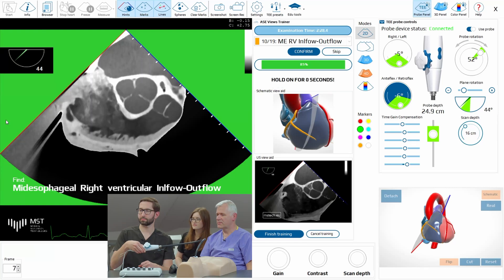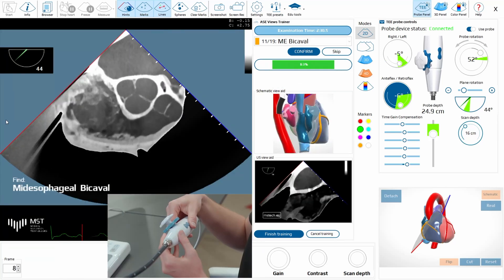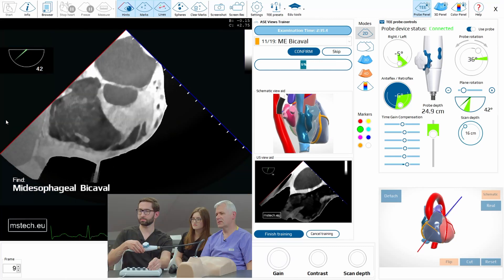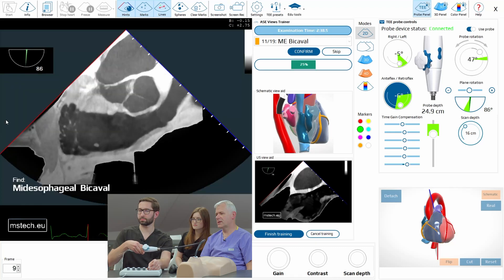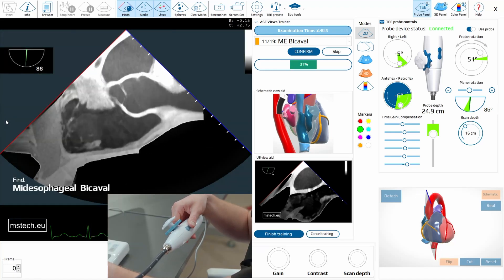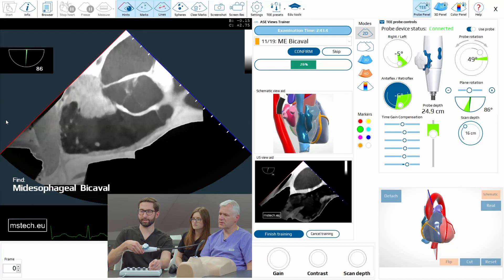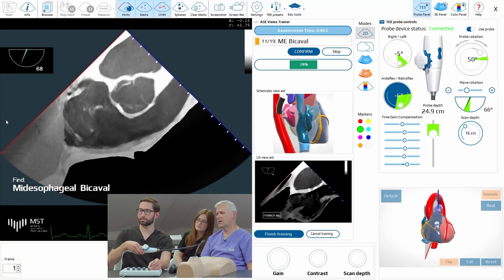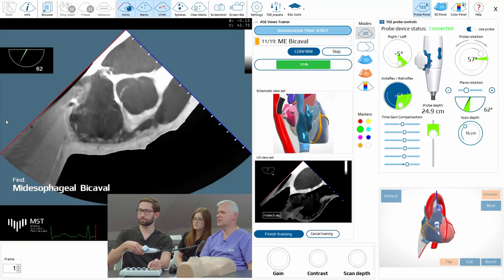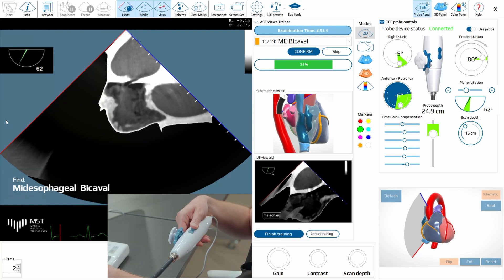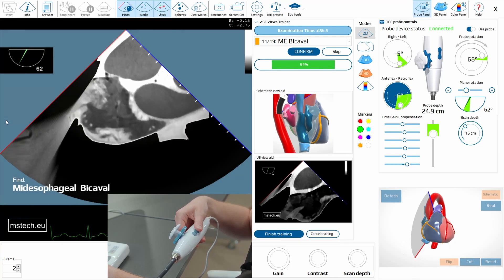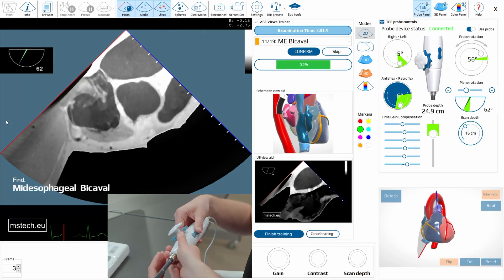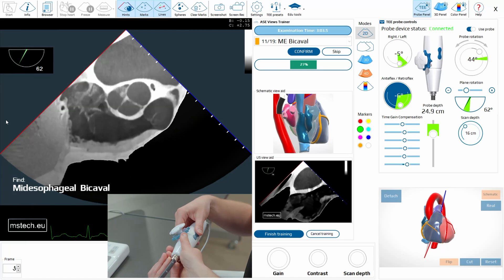RV inflow outflow. It's almost there, but you have to increase the angle slightly. Keep the aorta in the view. You increased too much — it should be around 60. Try to find it here. The aorta should be in the center, so you have to rotate like this and keep it here. Slightly increase probably.